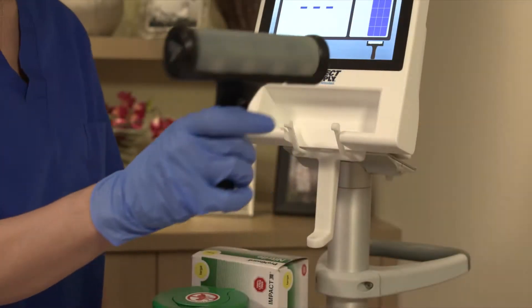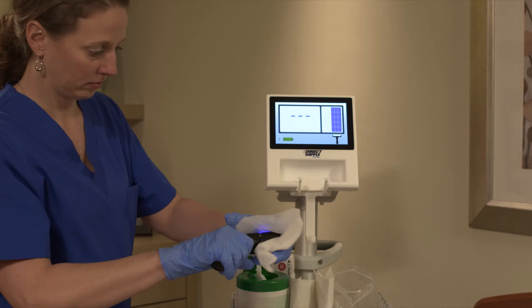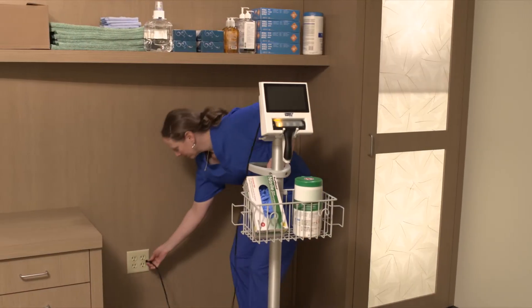Both the console and the wireless probe of the Attendant Prodigy Bladder Scanner were manufactured to be durable, easy to clean, and require very little staff maintenance.